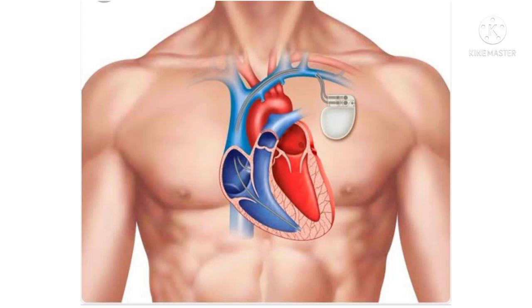Battery replacement: most pacemaker batteries last 6 to 12 years. Replacement requires outpatient surgery to open the subcutaneous pocket and replace the battery. Tell the patient that for the first few weeks after receiving the pacemaker, do not raise the arm closer to the pacemaker site above the level of the heart. Keeping the arm down will help the area heal and keep the lead from moving. Do not shower until the third day after the procedure. Gently wash the insertion site, but do not put lotion or powder on it.